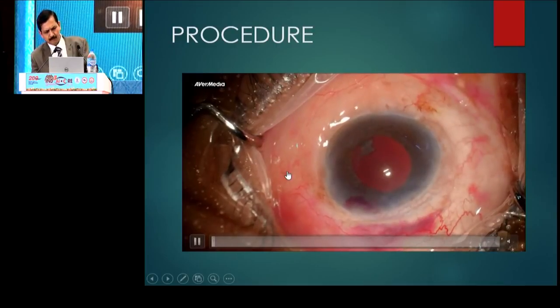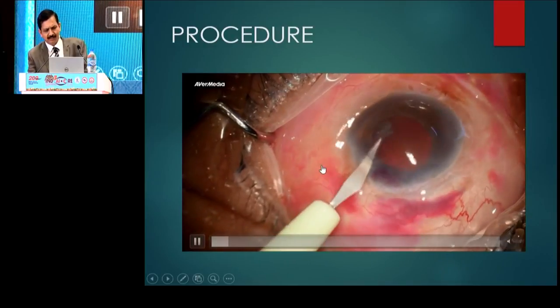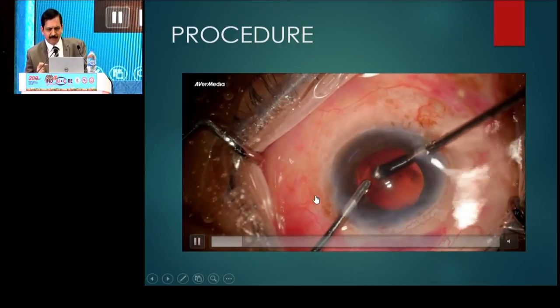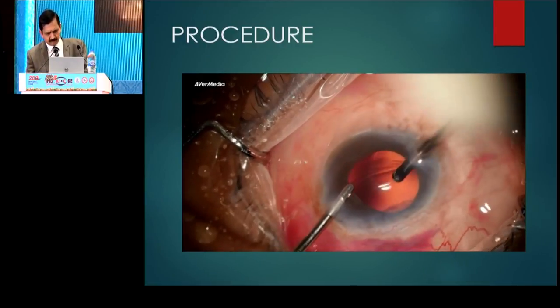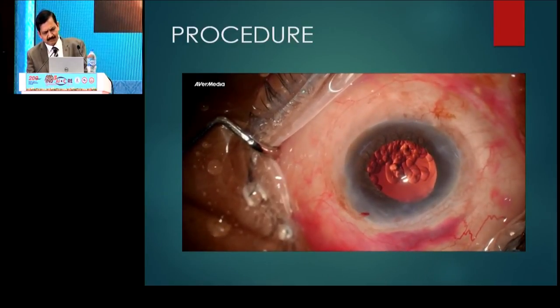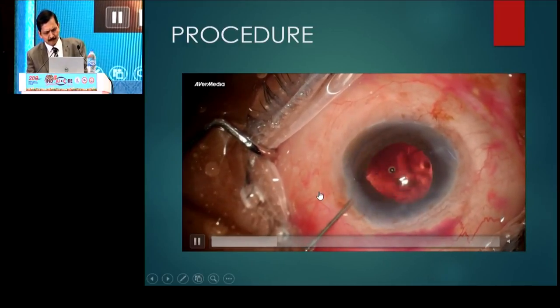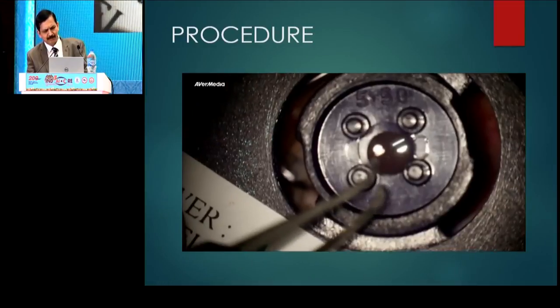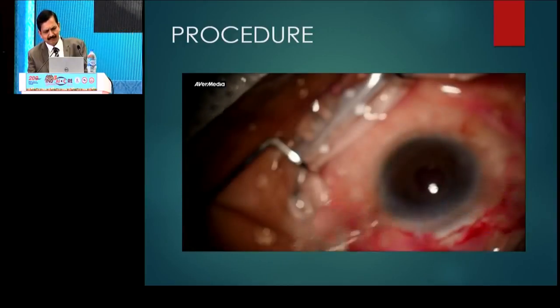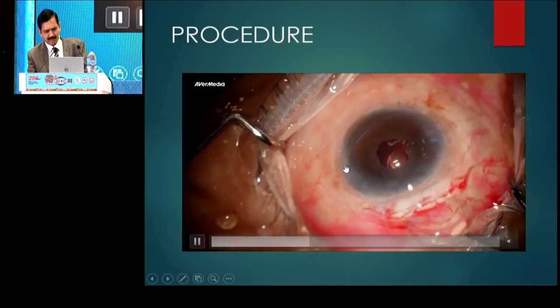This is exactly how I do this case — there is cortex and vitreous in the anterior chamber. The two side ports that you make should be exactly at the place where you are going to tuck the IRIS. After anterior vitrectomy, under viscoelastic, if the pupil is dilated, it may pose some problems. So I prefer to constrict the pupil using intracameral pilocarpine. Before implanting the lens, one has to check whether the claw is open and not broken.